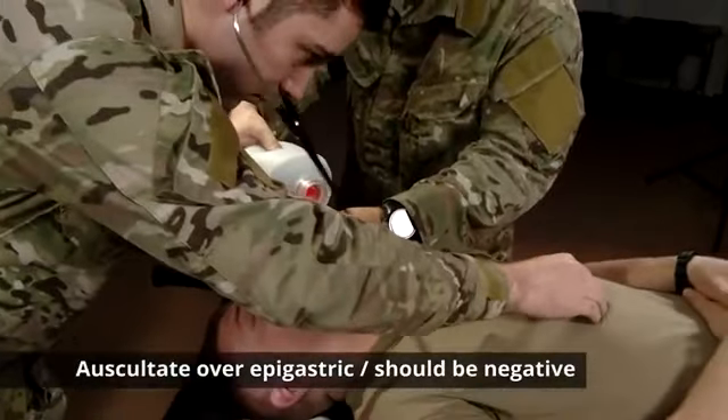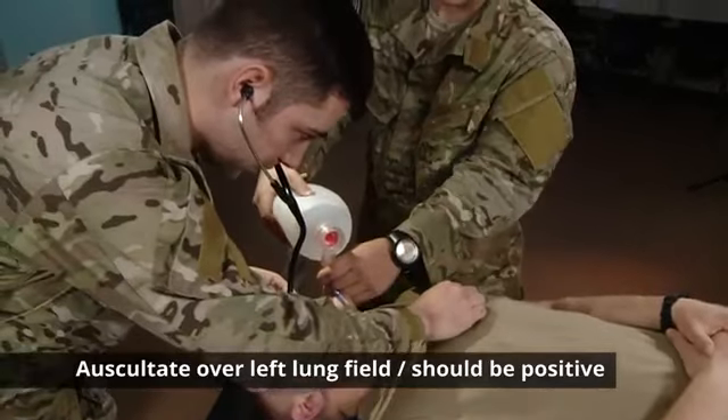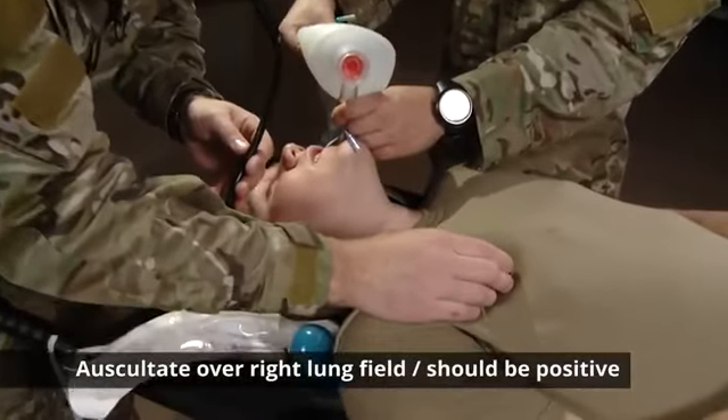Auscultate over the epigastric — negative epigastric. The left lung field — positive left. And the right lung field — positive right.